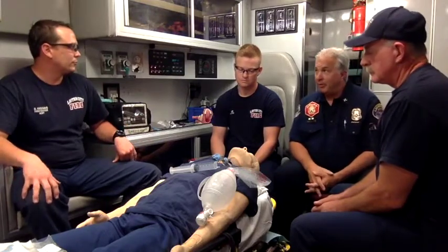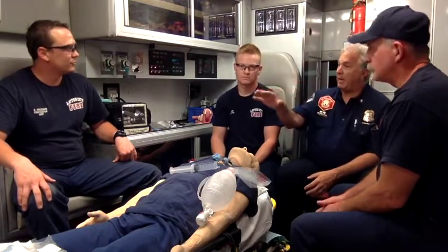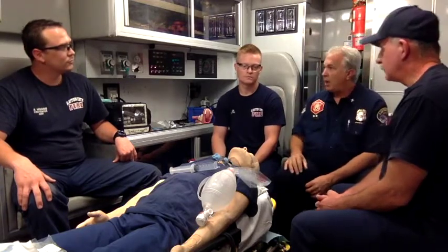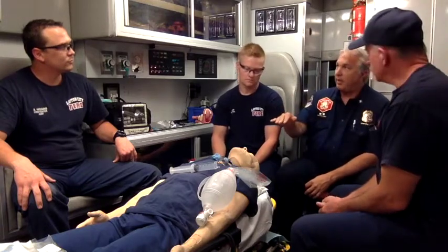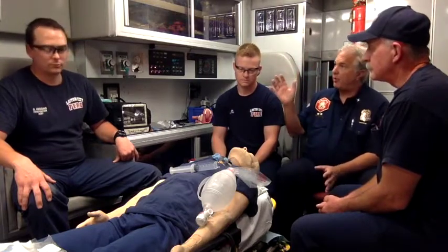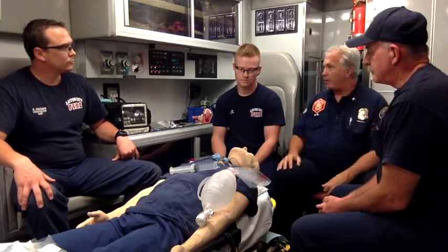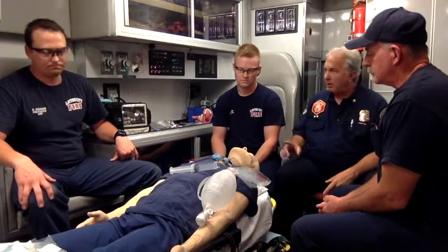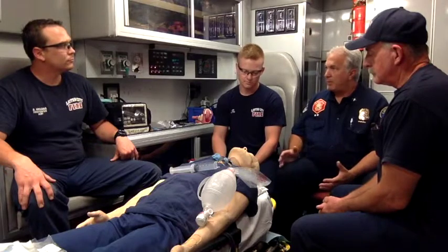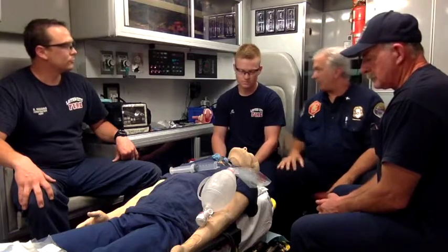What I'm trying to get across to everybody is I'm glad they're in here and not in the bags, because I believe, and if you listen to me talk, especially about RSI, the best place for us to manage airways is back here. Like you mentioned, better light, suction right here, every piece of equipment we need right here, multiple sources of oxygen. So are we going to manage somebody's airway by the side of the road or in their house? Absolutely we are. But especially when we start tiptoeing into the advanced airway thing, maybe we ought to think about getting the patient out here sooner rather than later. And I know that's not always possible.